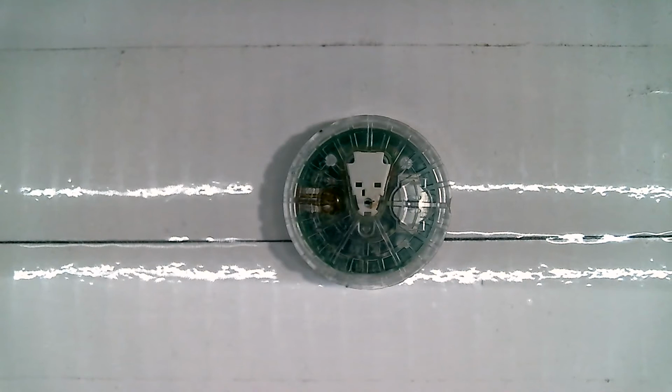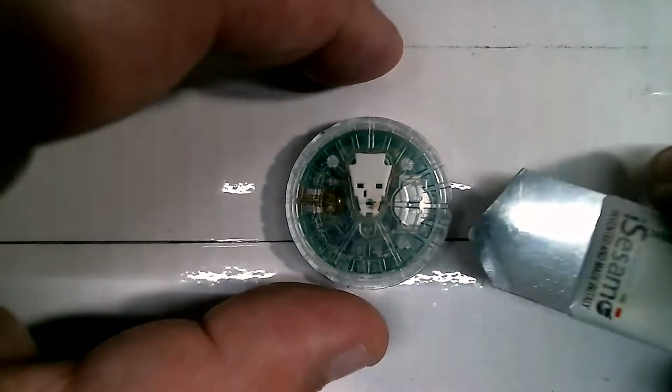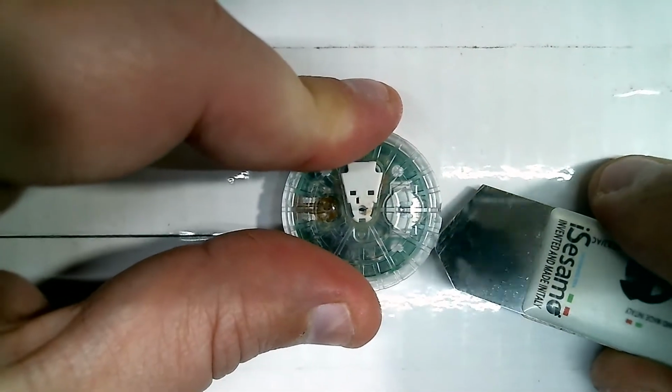No, it's not. So this is about the absolute closest that we're going to get, and let's see the focus. Well, now we're not going to focus at all, are we? So hold that thought. Let's go ahead and lock the focus and go from there. One sec, auto focus off. All right, that's about as good as we're going to get. So let's see if we can't get this little guy apart and see what makes it tick.